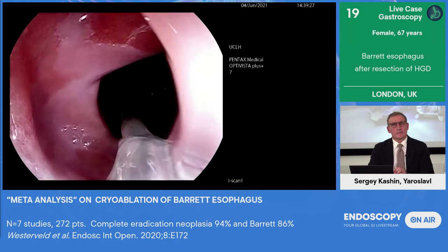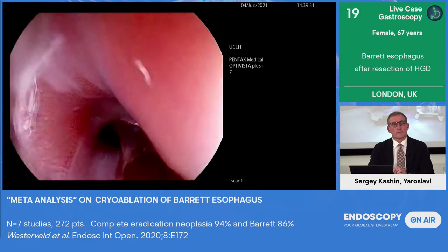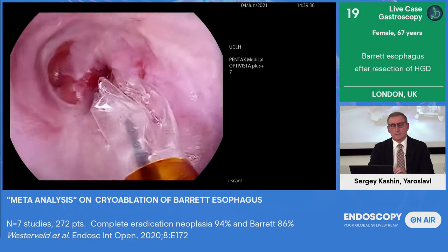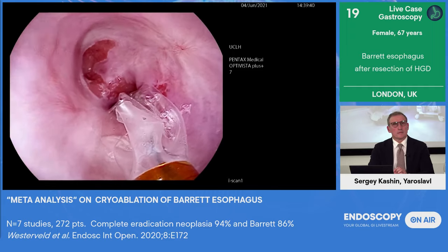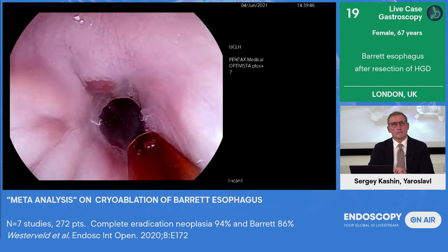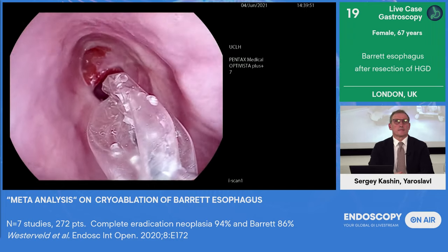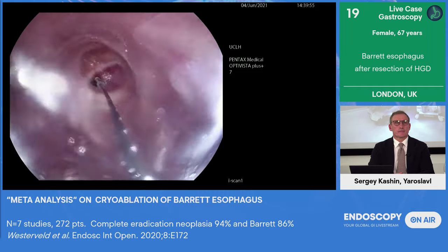You might ask, what's the benefit of cryo in these cases? We don't know. We're still working on collating prospective data in treatment naive patients. We've shown that in treatment refractory patients, this will have a role. And you know, studies will begin to inform its role. There's already good data from the US. The other challenging aspect of this esophagus is there's a bit of a pseudo diverticulum that we've created as a result of the endoresection.